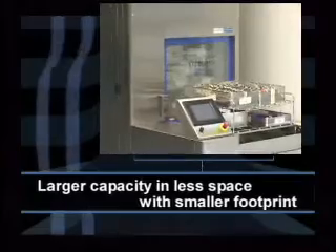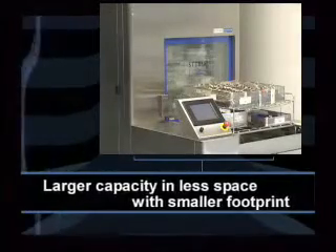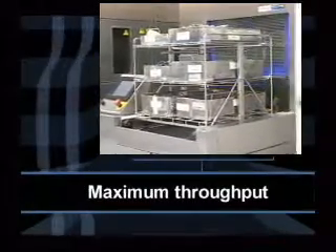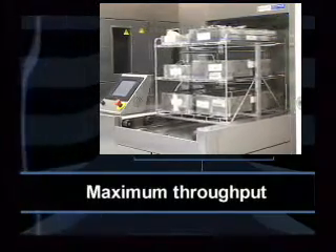Larger capacity and less space with a smaller footprint allows for more efficient use of valuable floor space. The high-capacity Reliance Vision System helps you process a high volume of medical devices, utensils, and delicate instruments more efficiently.